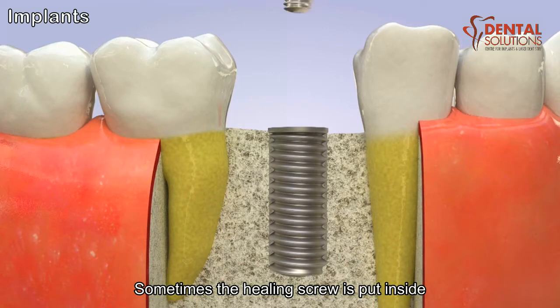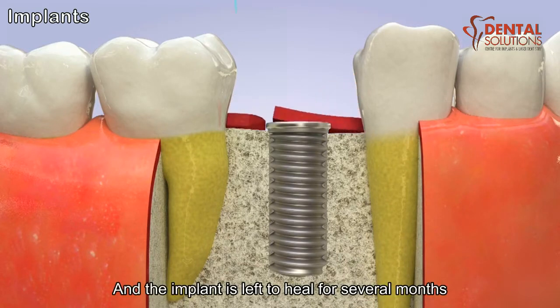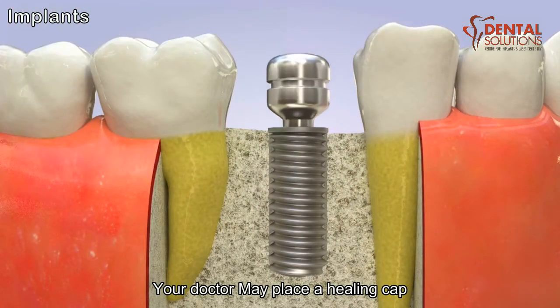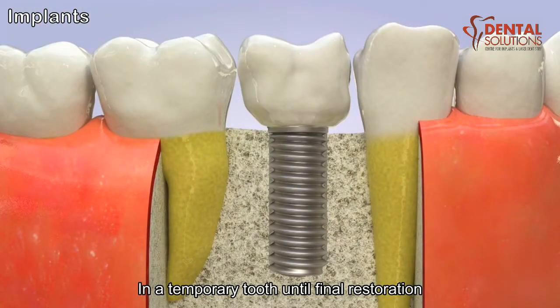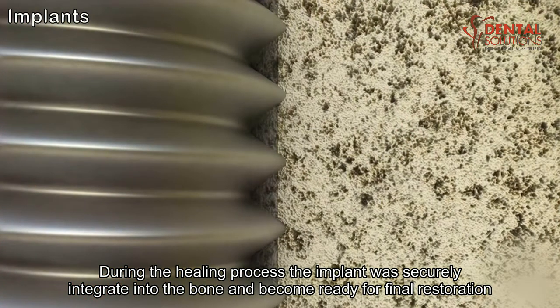Sometimes a healing screw is put inside, the gums are closed, and the implant is left to heal for several months. In other cases, your doctor may place a healing cap or an extension and a temporary tooth until final restoration. During the healing process, the implant will securely integrate into the bone and become ready for final restoration.